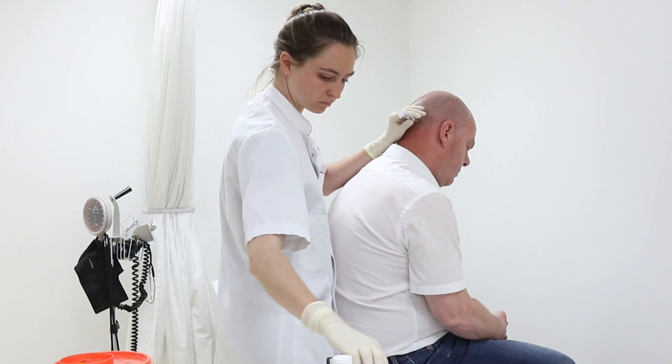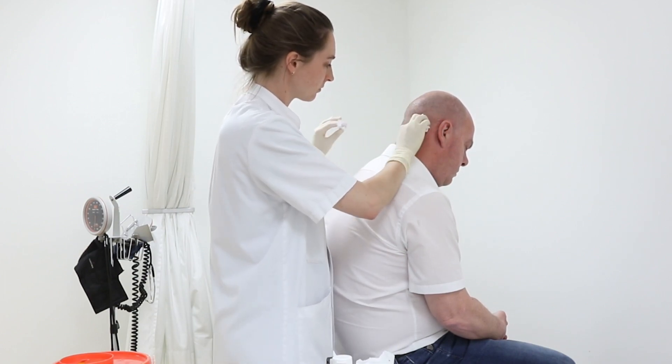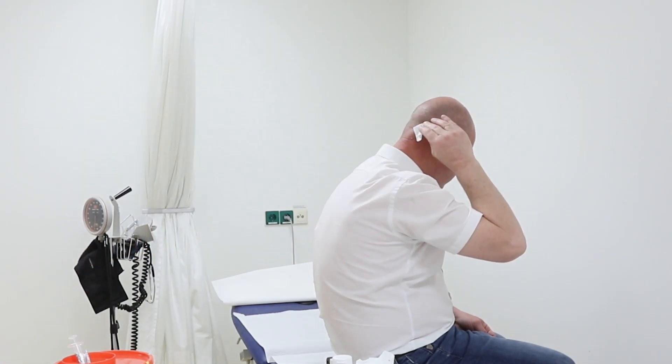Cover the injection site with a gauze and then remove the needle. Let the patient gently press the injection site with the gauze while you clean up the needle and other items. Let the patient sit for several minutes to prevent a vasovagal reaction.